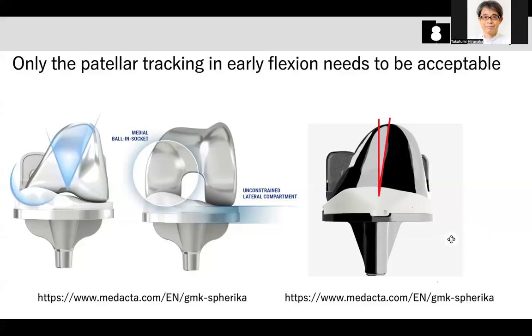So 3 degrees or more for guiding the patella in early flexion.